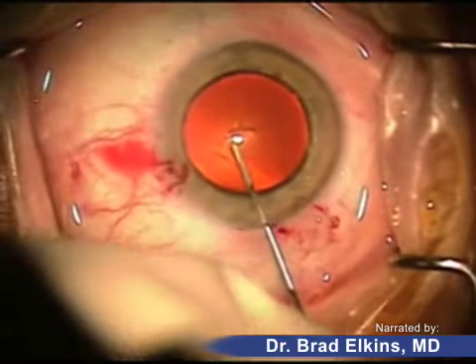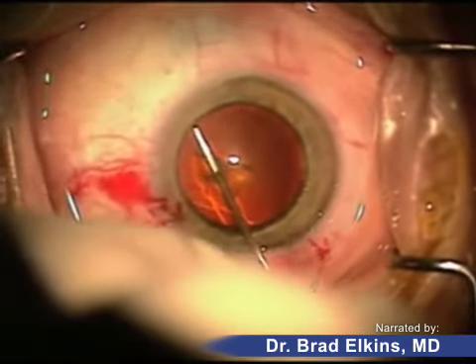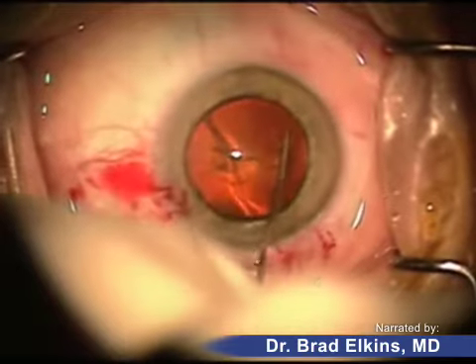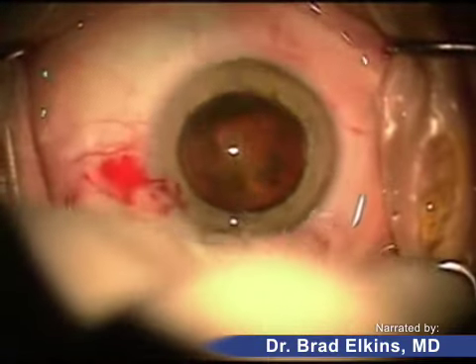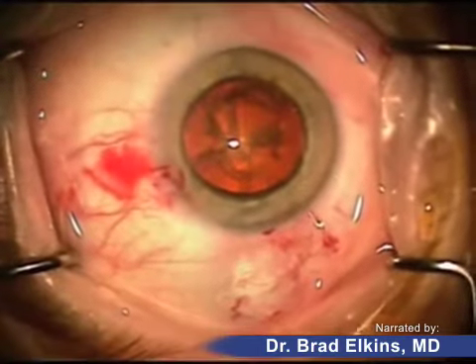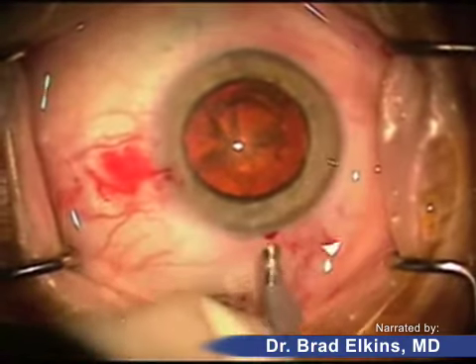A little bit of fluid is going to be injected inside the lens capsule to free up what we call the nucleus — the part of the lens that, as you can see, is almost popping forward. The nucleus needs to be freed so it can be easily moved with instruments during the surgery.